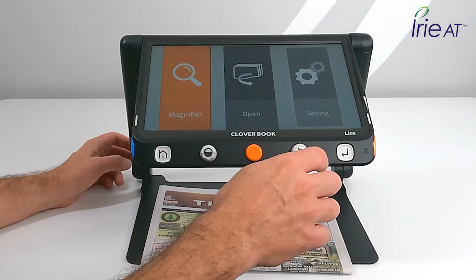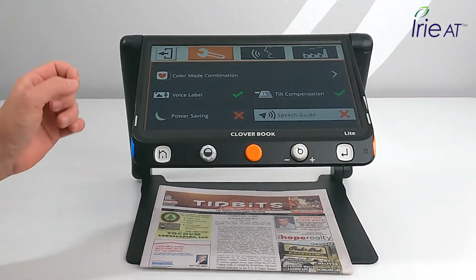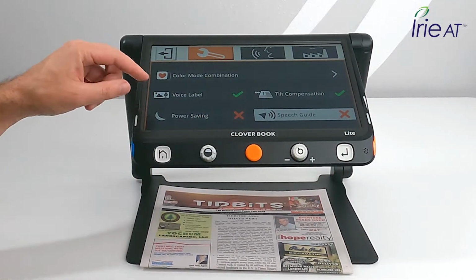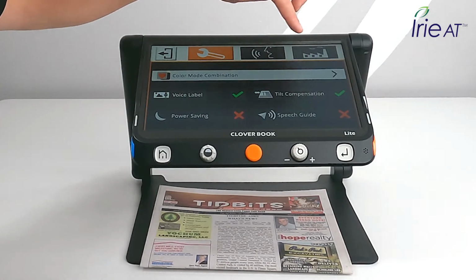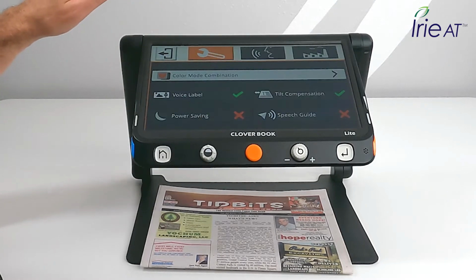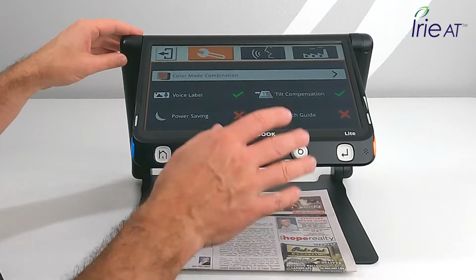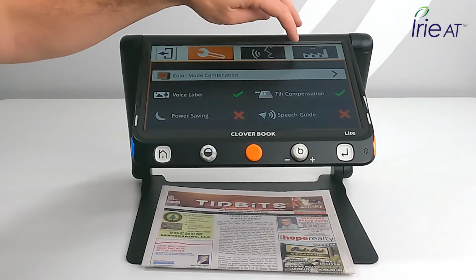The last option is setting. Option speech guide disabled. So I've got all sorts of different things. I've got a speech guide I disabled and power saving. But besides that, I have voice label on. I can also get to the color combinations this way. If I don't want to long press on the button, I can go into the settings and do that. There's a tilt compensation. So if the camera's tilted, it'll still straighten everything for you. Maybe you don't want that for some reason, turn that off.